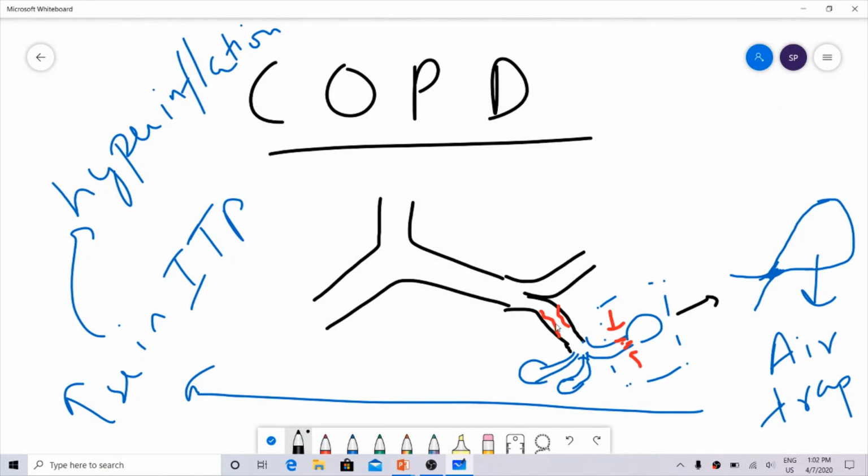So in COPD, this is where you are having the problem: chronic bronchitis. And if it occurs at the respiratory bronchioles, there is collapsing which leads to air trapping, and this can increase the intrathoracic pressures as well, which can cause hyperinflation. This hyperinflation is actually bad, and that is why you see a large lung and an increase in the size of the intercostal spaces. And whenever there's hyperinflation, there is hypertranslucency, so the black color of the lung is more enhanced in these patients. Now, you can see there is air trapping here.